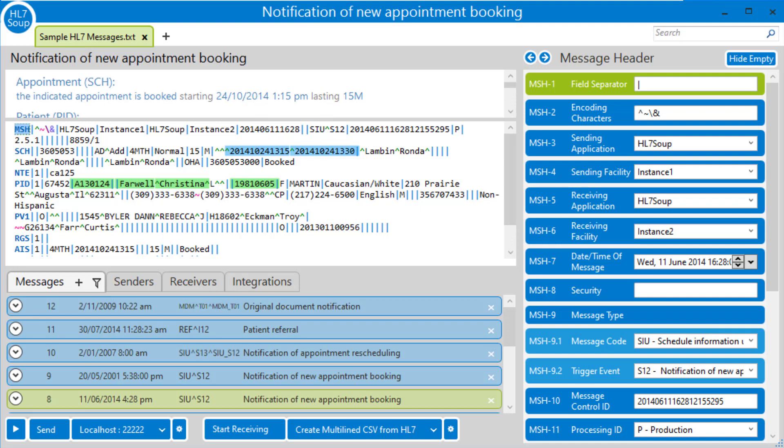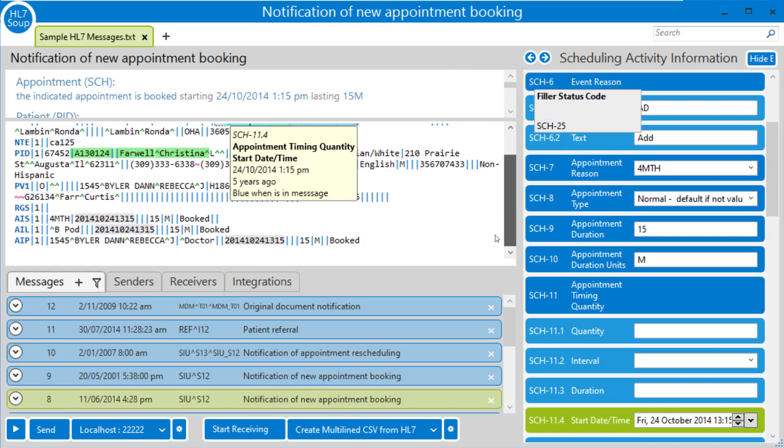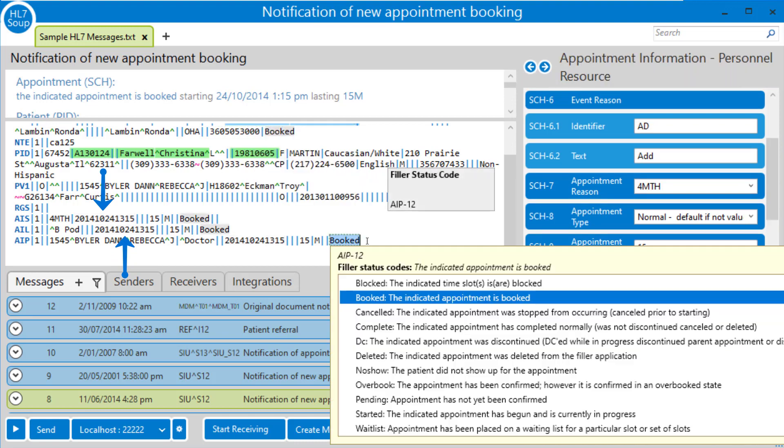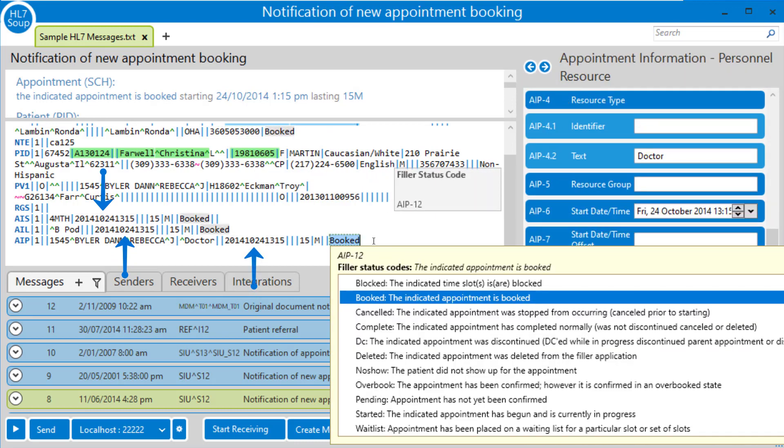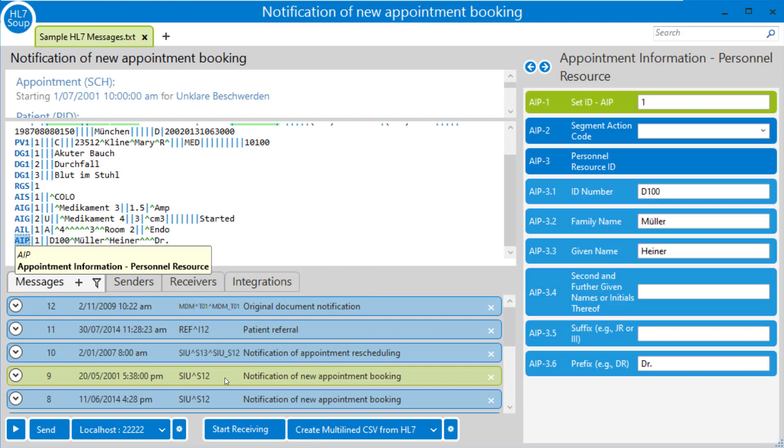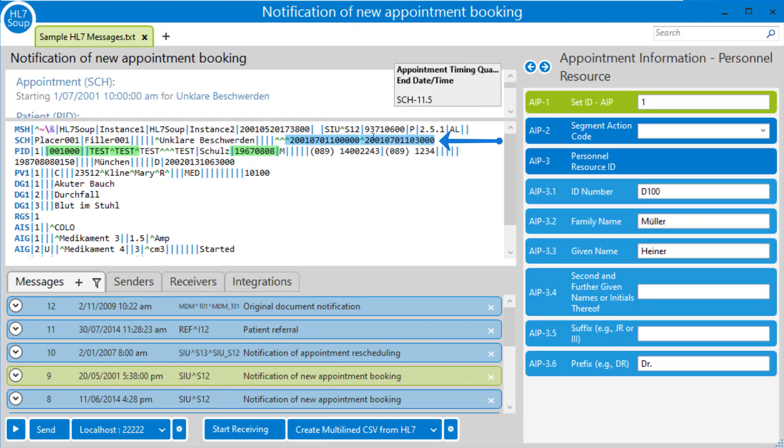There are other places you might find the appointment date. If I click on here, we'll see also highlighted is the AIS, the AIL, and the AIP. So depending on your message, you might find your dates in different locations. But for the two messages we've got here, both of them have their dates in the SCH 11.4.